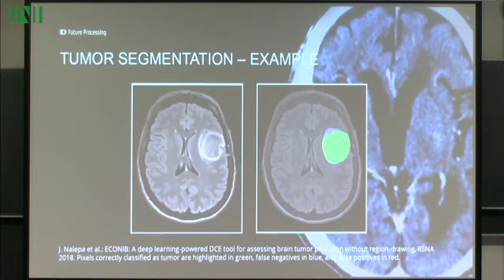So this U-type architecture of deep networks, and we have a training set which is composed from data which is acquired at our site. Our clinical partner delivered us data and ground truth segmentation, so we know what should be the real segmentation, and we can build a model based on that data. It's data-driven, as we discussed today, so it has advantages and disadvantages, but that's the way we went in this project. I think we can somehow prove when and how it works.